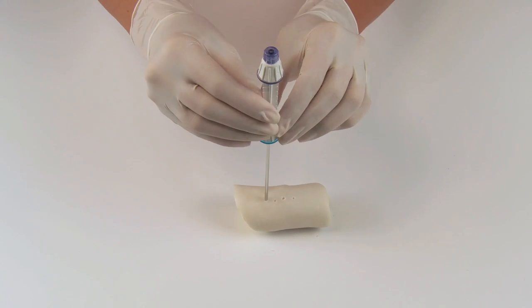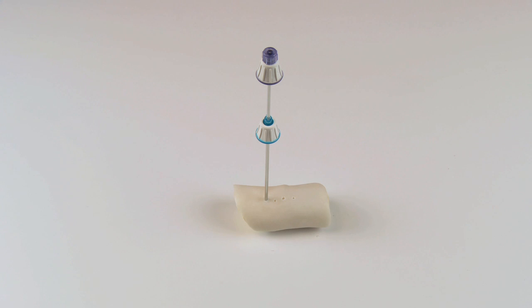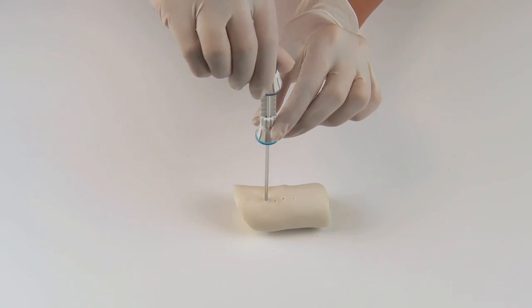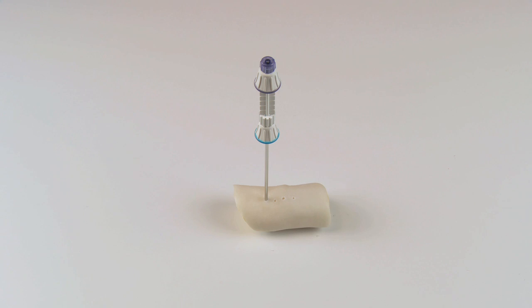Break off the number of indicators needed to reach the target lesion. Each indicator is 5 millimeters. Advance the biopsy needle with the stylet inserted to the stop. The tip of the biopsy cannula is now at the targeted lesion.